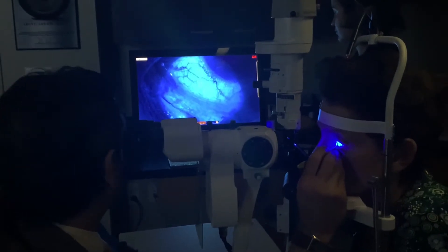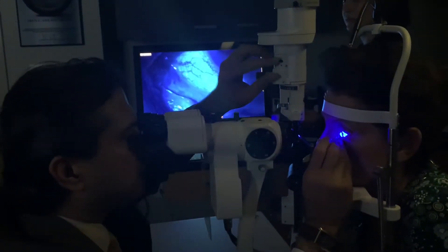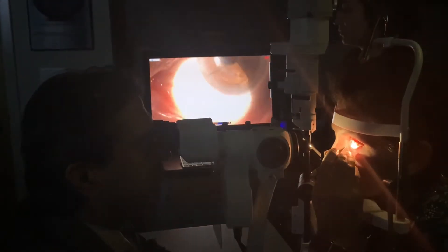This is fantastic. Are you comfortable? Yes, sir. It's super. Very nice.